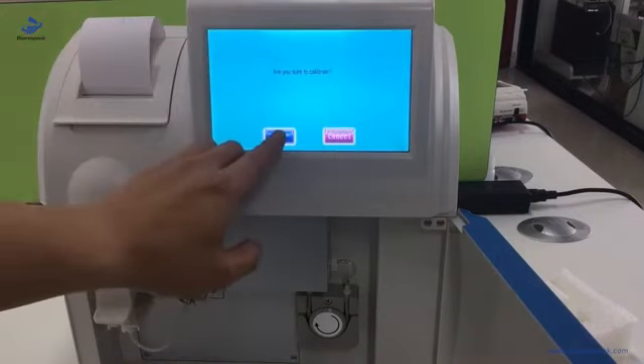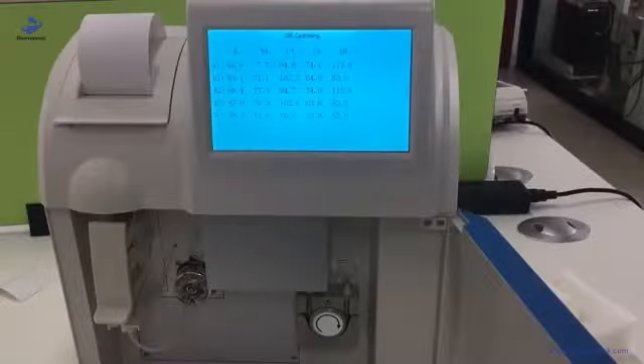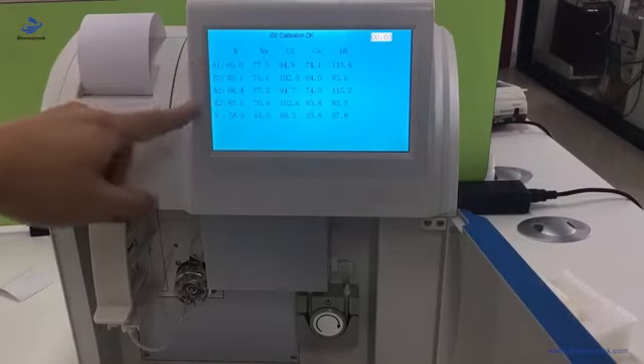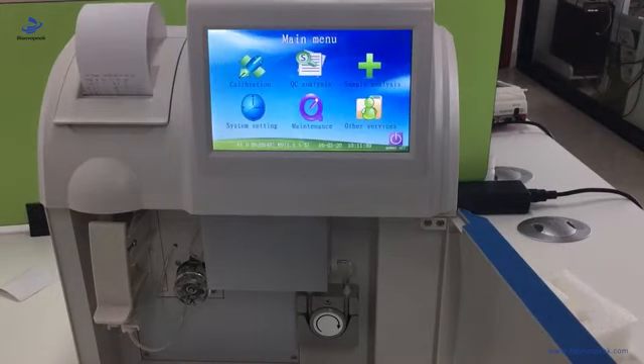Press OK. It will take some time. After a while it will finish the calibration and show the result, then print out the calibration result.